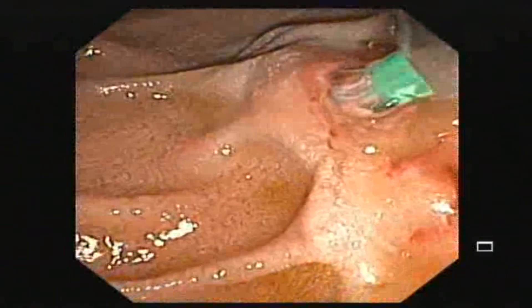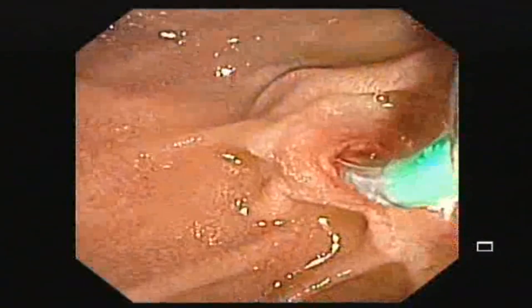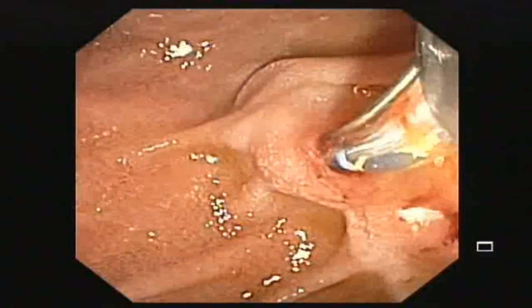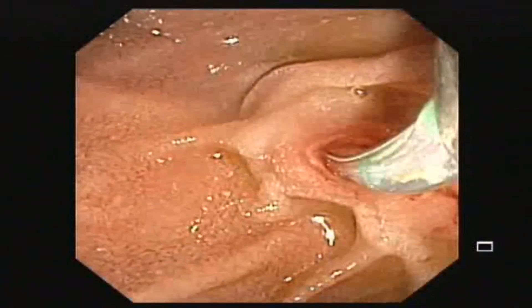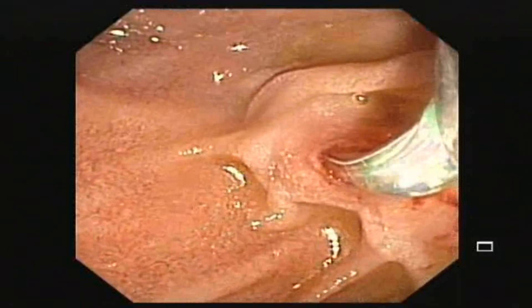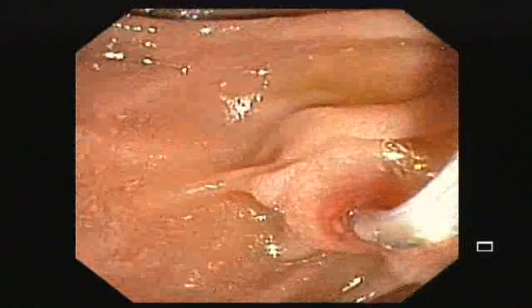Contrast is put into the common bile duct to see if there is any sludge or another worm in the CBD under fluoroscopic guidance. A guidewire is then passed into the CBD.